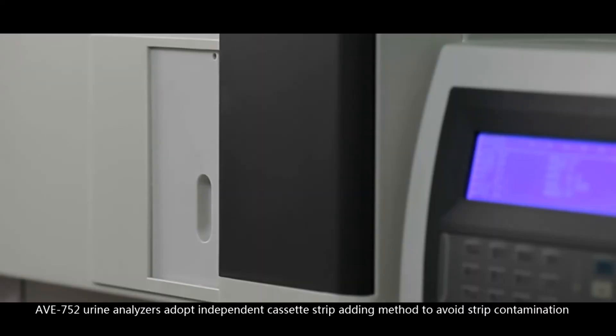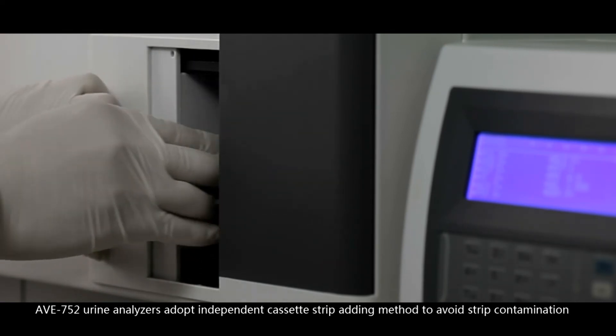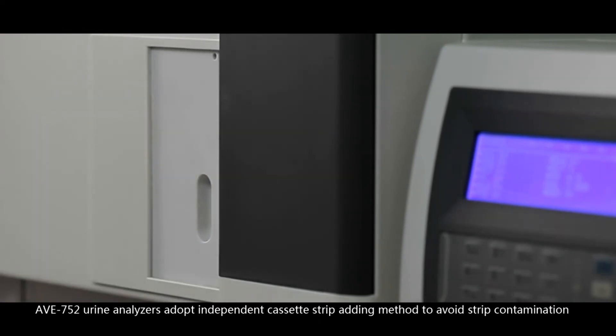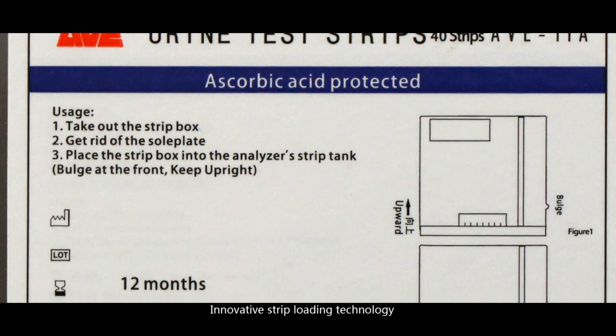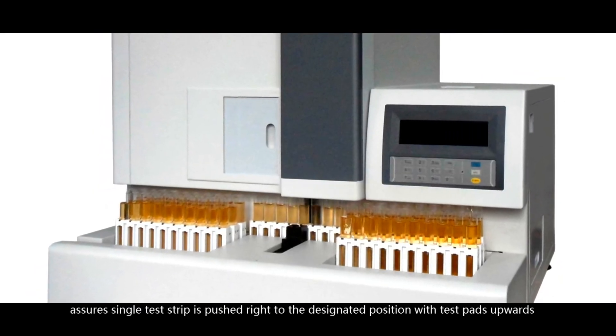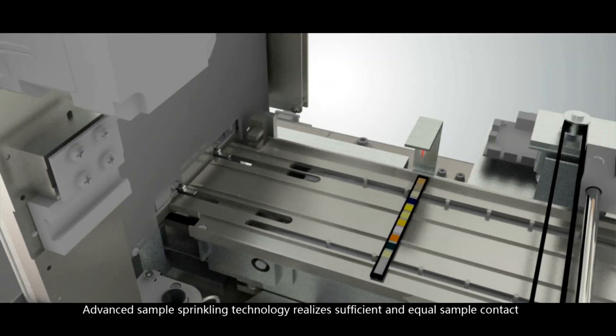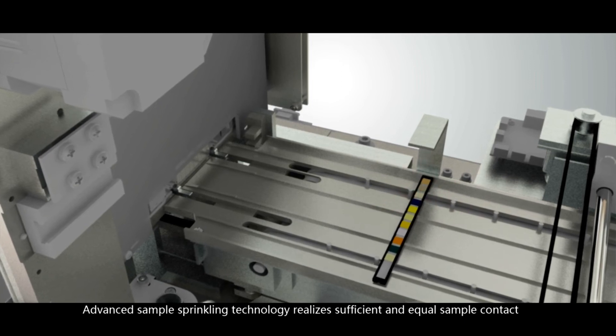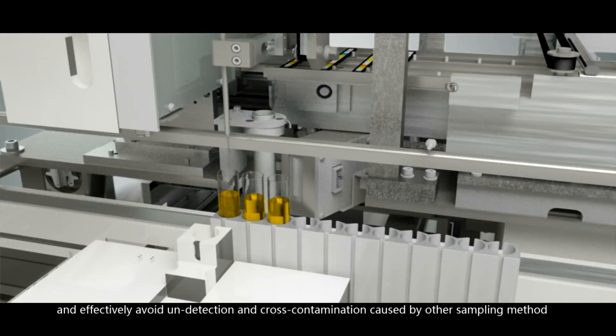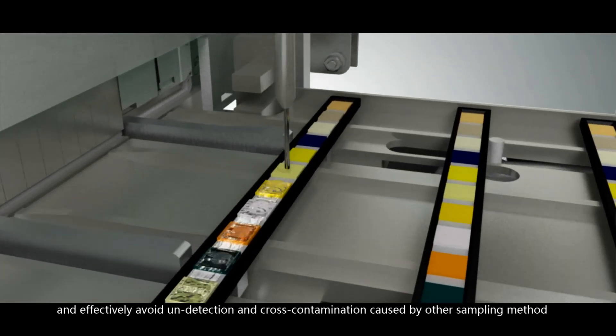AVE-752 urine analyzers adopt independent cassette strip adding method to avoid strip contamination. Innovative strip loading technology assures single test strip is pushed right to the designated position with test pads upwards. Advanced sample sprinkling technology realizes sufficient and equal sample contact and effectively avoid undetection and cross contamination caused by other sampling method.